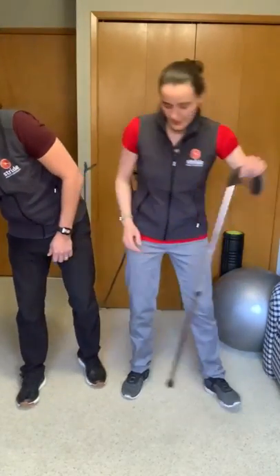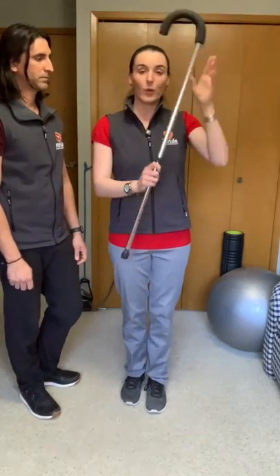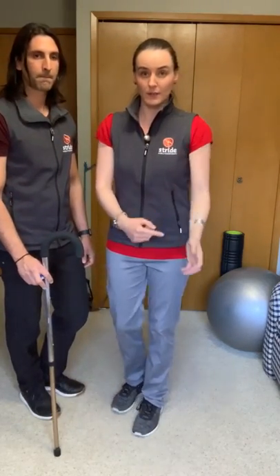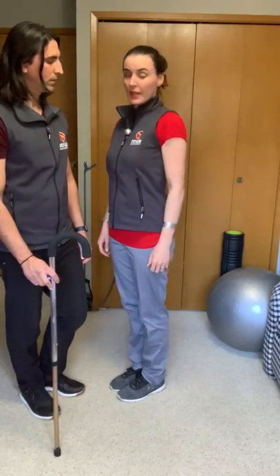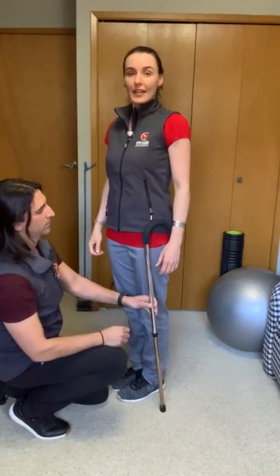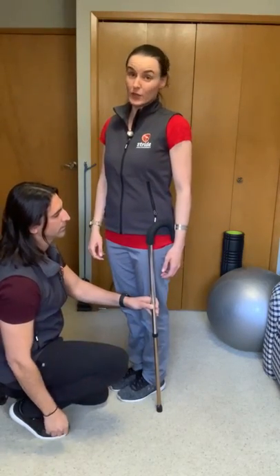So this cane was way too tall for me — too bent an elbow. We're going to need to size this one down. We're going to use the creases of the wrist, which line up roughly with that hip bone or greater trochanter. With a nice, relaxed arm, you bring the cane and you'll want the top of the cane to line up with those creases. As you can see, this is way too tall, so let's make it shorter.